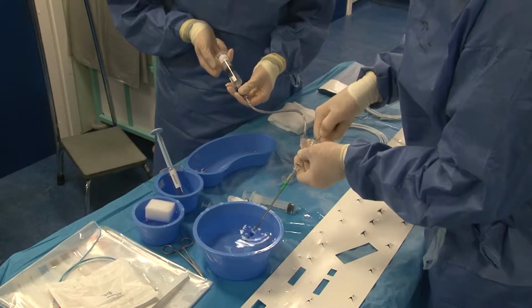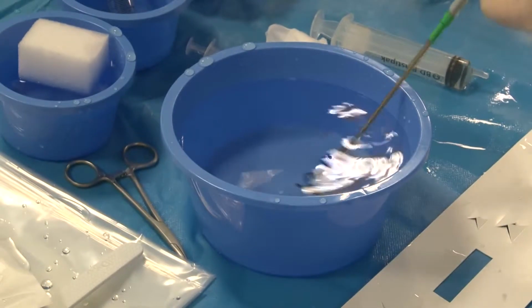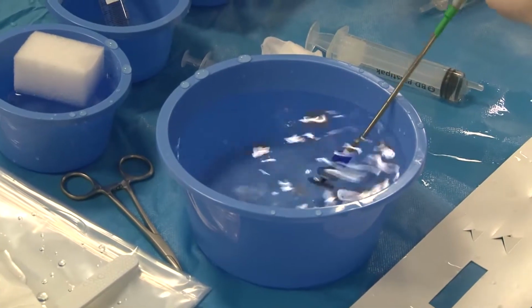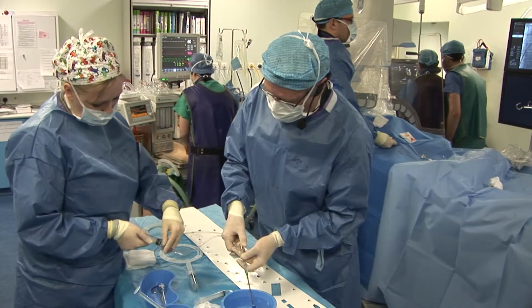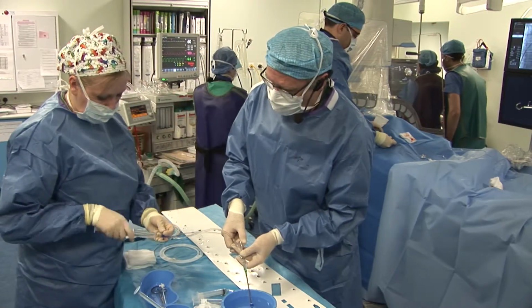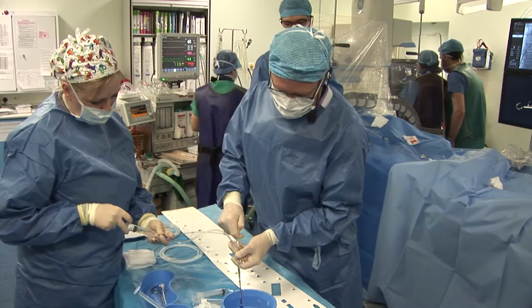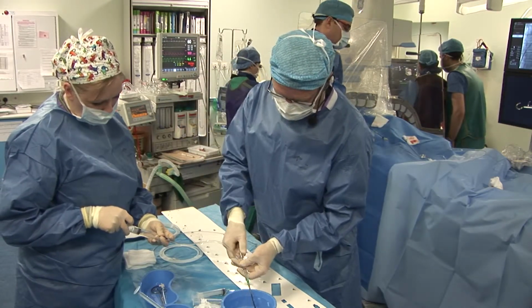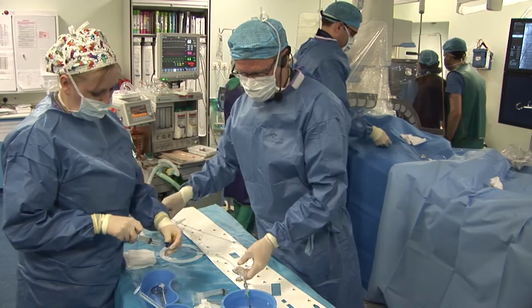And then what I also do is just bring the device out under the saline again, just to make sure there are no bubbles trapped within. And we've actually got one or two little bubbles. Okay, and then one last flush, Lisa, if you do an exchange. We'll pull it back when you're giving a good flush. Okay. And we'll pull it back as we're flushing. Make sure that's good and tight. Okay, and I think we're ready to go, yeah?